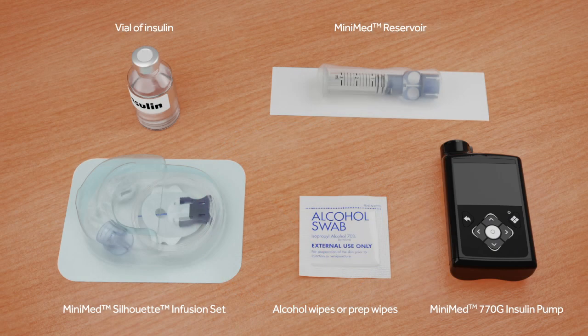Before you begin, wash your hands and gather the items you will need to change the reservoir and infusion set.